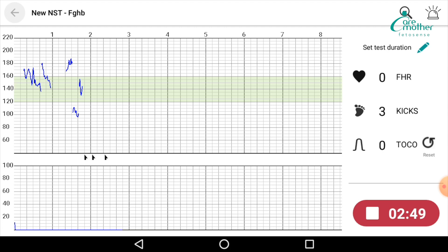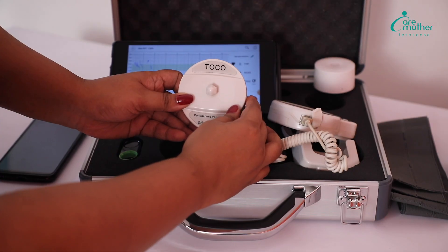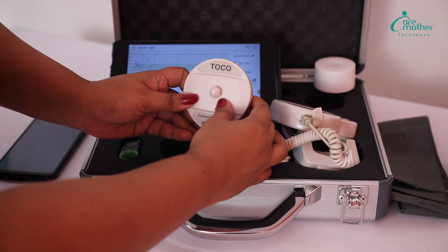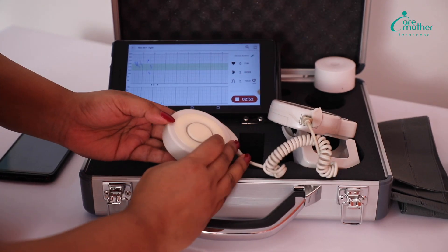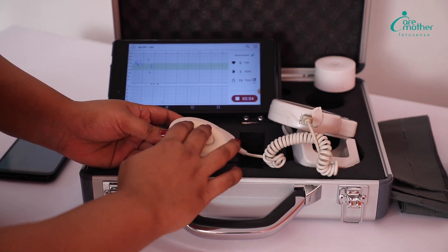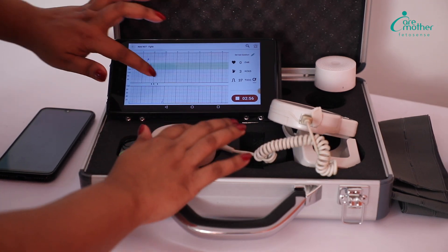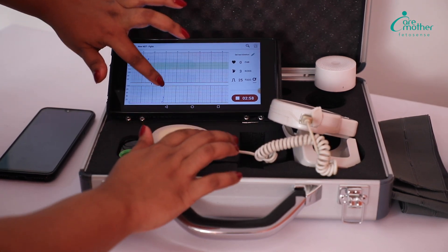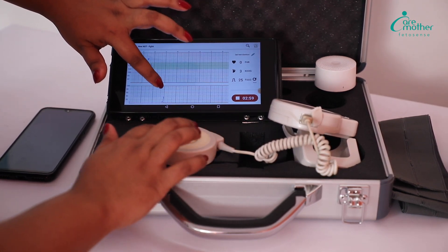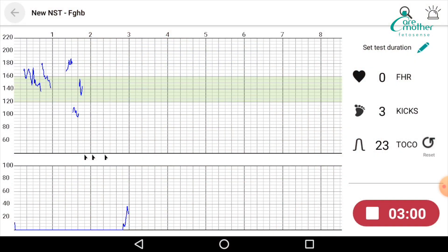Let me show you some traces of TOCO as well. Here is the TOCO probe — I am moving my fingers on it, and you can see the TOCO tracing happening on the bottom side of the test screen.